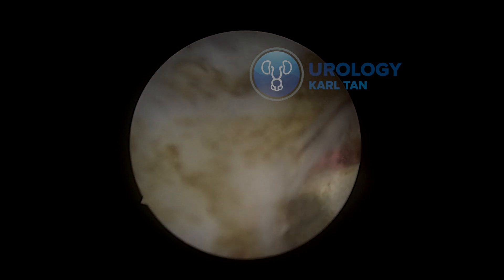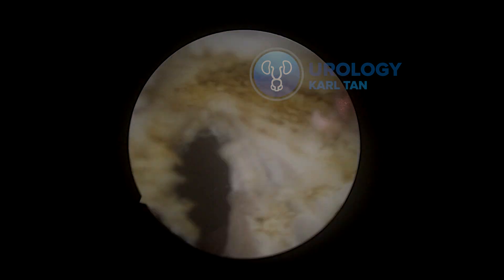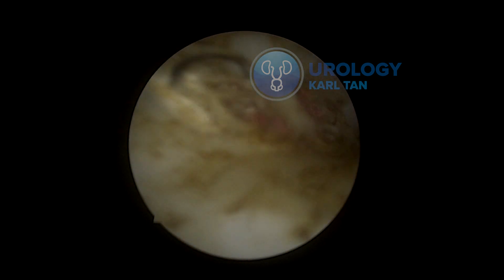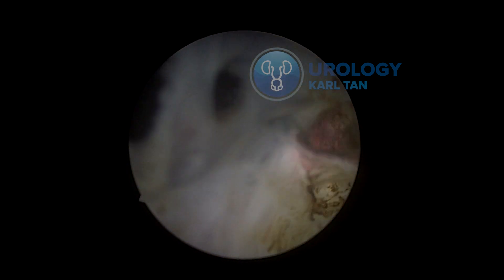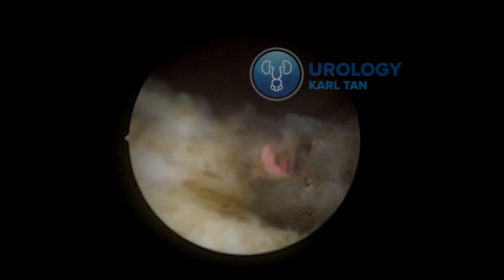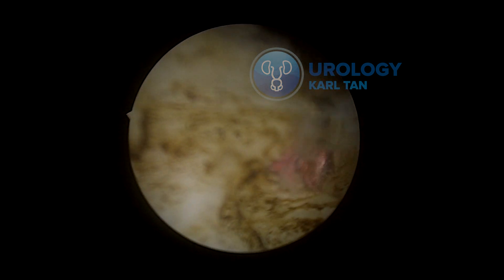Now I'm doing the incision at 12 o'clock of the prostate up to the bladder neck. Once I'm able to get to the bladder neck, I release the upper part of the lateral lobe, then incising the bladder neck and going down following the groove of the bladder — up to the level of the bladder floor, which I call the equator, where the prostate gland, bladder neck, and bladder floor meet.